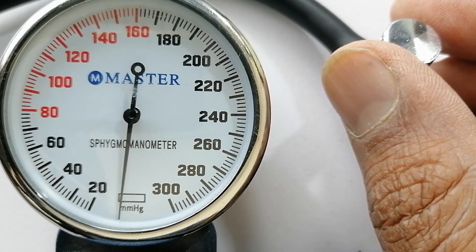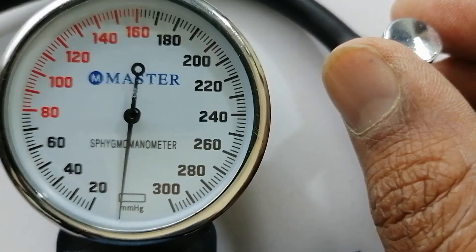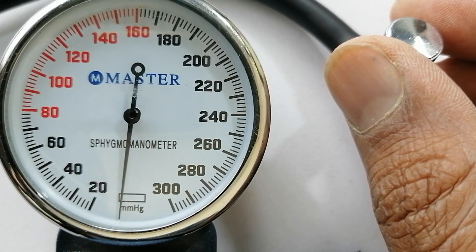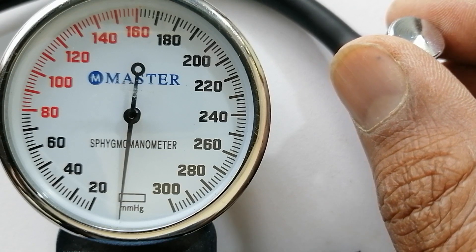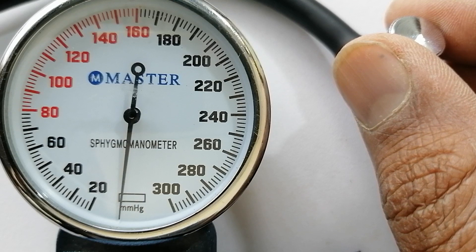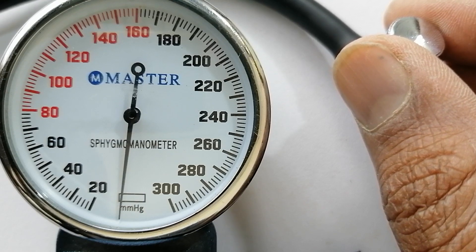There will be a point where you can hear the sound of the pulse. This will be my systolic blood pressure. It is your responsibility to pay attention to the sound. As soon as you hear the first thump, see where the needle is at that moment. That is the point you have to note.